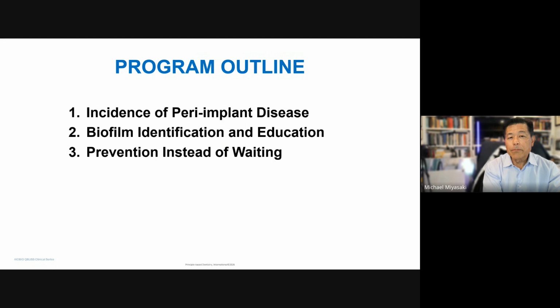I want to talk about biofilm identification and how we use that equipment to educate our patients on the importance of biofilm and their implant health. And then on point number 3, I want to talk about what we're doing today to help prevent peri-implant disease and not just let it happen.